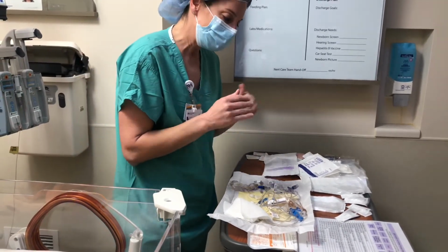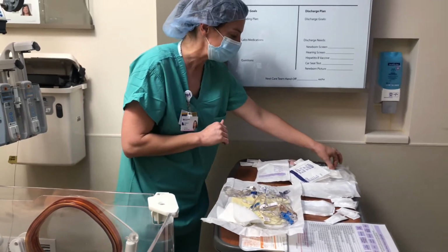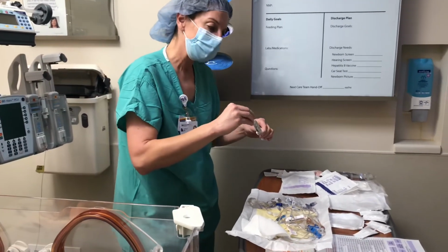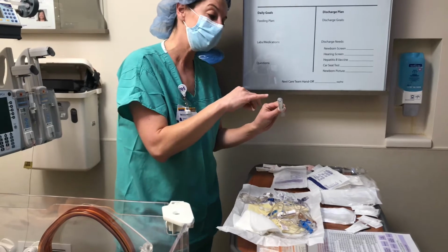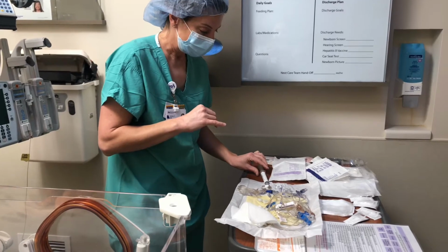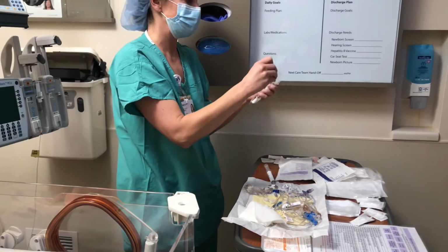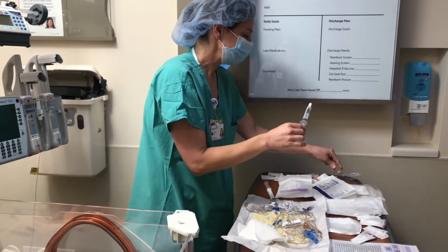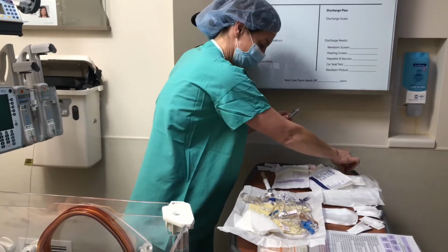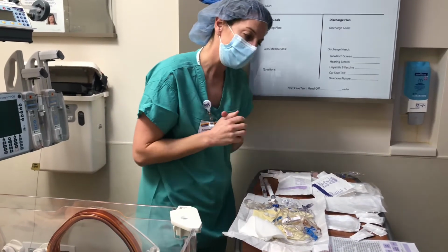Okay, so now we have all our supplies open on our sterile field. The next thing I'm going to do is remove the caps that come on my syringes, and this is my lipid syringe, and I'm going to position these so that the luer lock portion of the syringe is on the sterile field edge. And then remember, our saline flushes that we take out are not sterile, so we don't want to put them onto a sterile field. I'm going to remove the cap, and again, I'm going to put that on the edge of my sterile field. Okay?